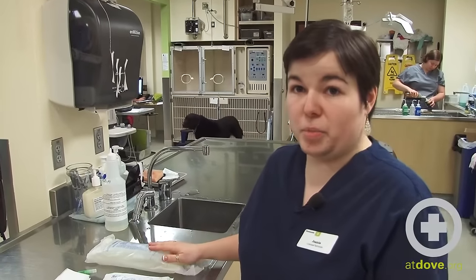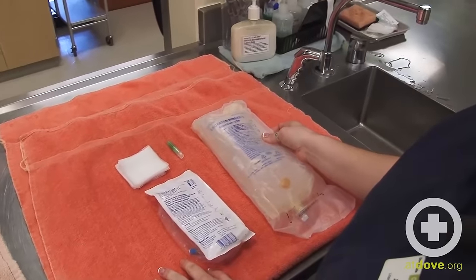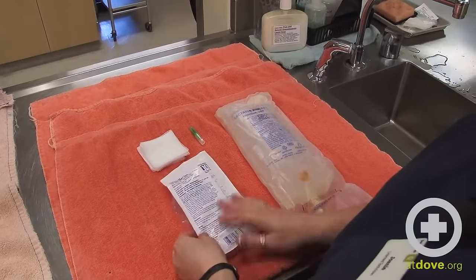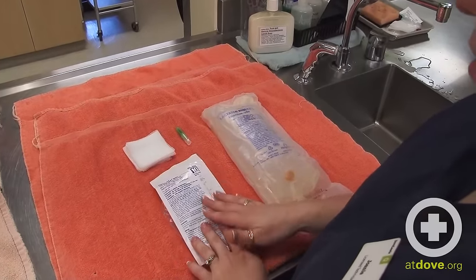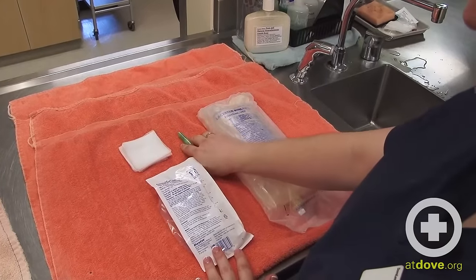Hi, my name is Joni. I'm a technician here at Dove Lewis, and today we're going to talk about how to give sub-Q fluids for home administration. Here I have my lactated Ringer's solution, which is typically what we send home for sub-Q administration. Here I have a drip set — they're individually pre-packaged and sterile — some gauze for drying up afterwards, and a needle for administration.